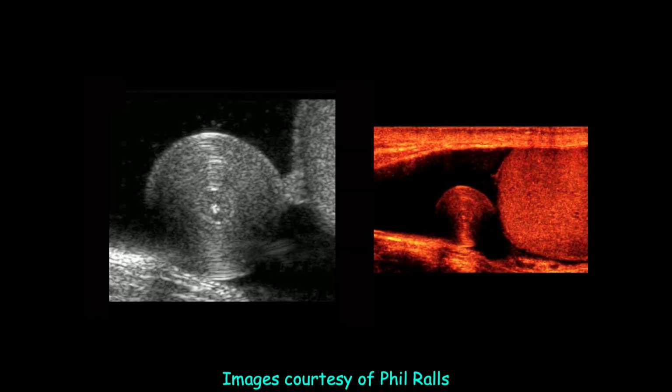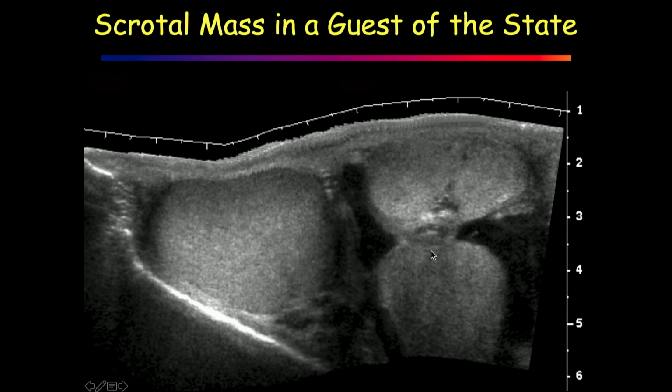Phil was at USC, at the county hospital at LA. They saw some amazing stuff out there. He called this the mother of all pearls here. Look at this lamellated thing just rolling around inside the scrotum. We're very politically correct in academia, so we can't call people prisoners, so our texts call these a guest of the state, or this gentleman comes to us from a gated community.